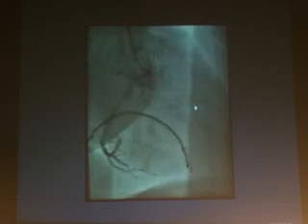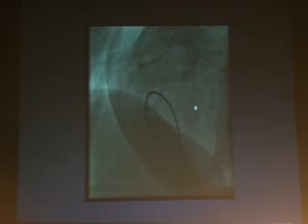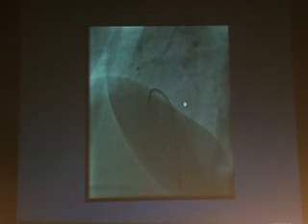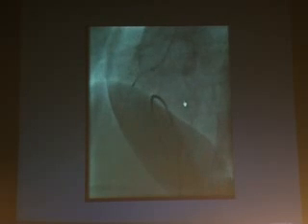If you can see here, there was a lesion in the proximal segment, there was a bend in the proximal segment, and then there was tight disease in the mid RCA. When we burred, in the initial part, we tried to force the burr from the proximal segment. Now, if you are using a smaller size burr, by sheer pressure, or if you are slightly rough, it will go distally.